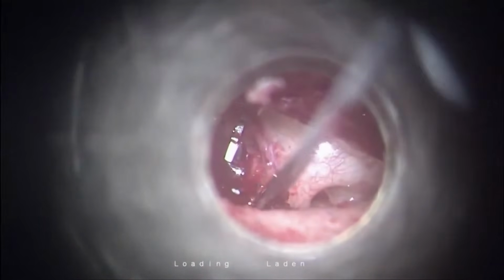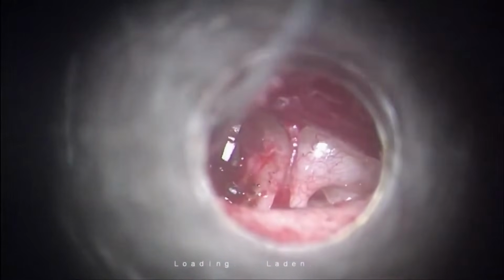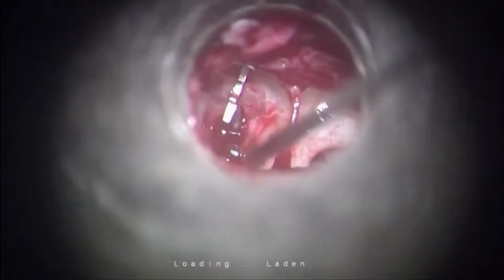The vestibule is completely full of perilymph, and this is the best sealant, I believe. We never use anything like gel foam or any tissue like fat to seal the fenestra. There is no need. If your piston is of adequate length, you don't need to seal the fenestra at all.